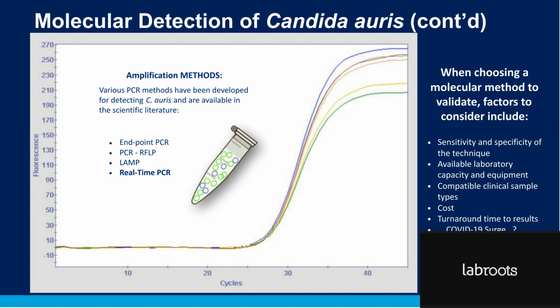In my specific experience, we were in the process of considering implementation of C. auris molecular methodology, as we will see later. We started thinking about this at the end of 2019, actually probably earlier than that, but started making the final plans for actually going live at the beginning of 2020 with this new test, until, of course, COVID happened, and we had to put everything on hold and deal with the more urgent threat at the time.